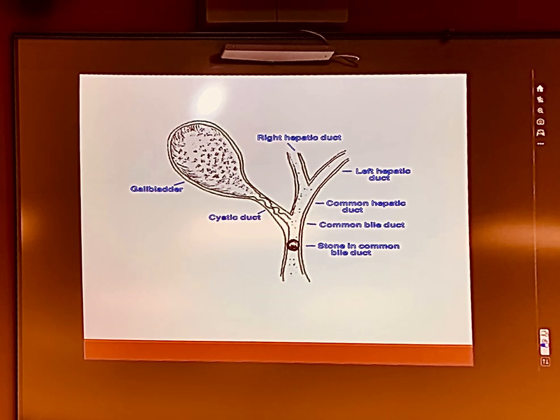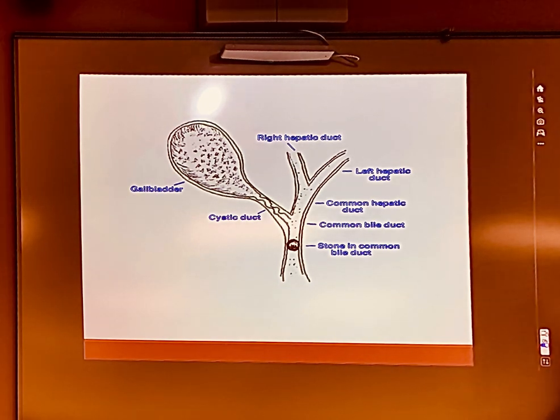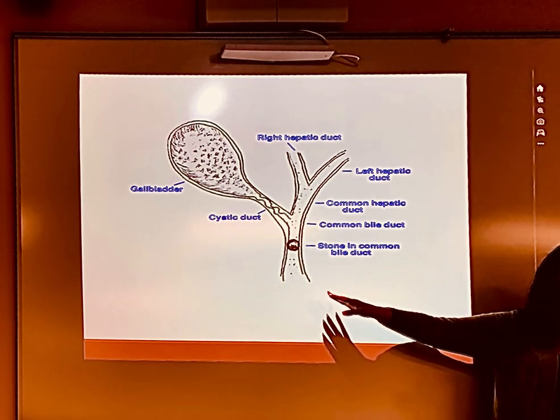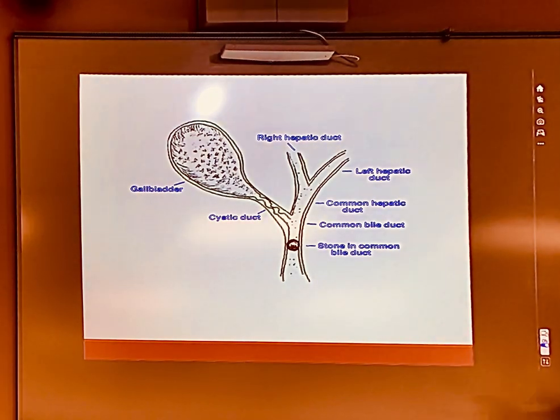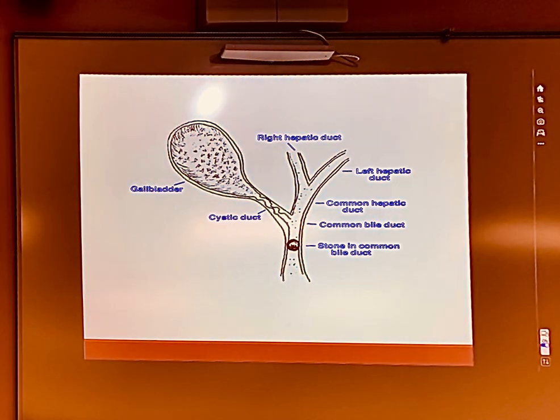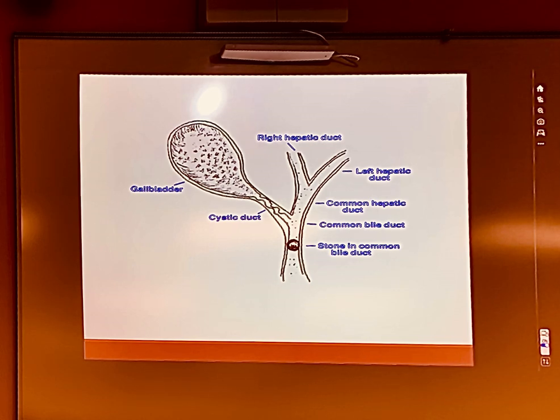Which is why a lot of times the radiologist will say, give them milk, don't give them CCK if you have no bowel. Unless they have another modality that's proven that they don't have an obstruction. And sometimes that's our job to find. So the scan would show liver and gallbladder, but no bowel.